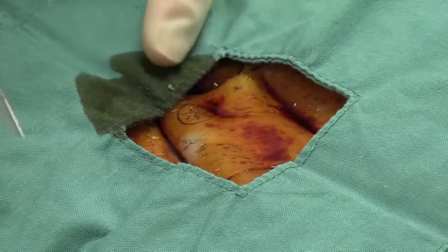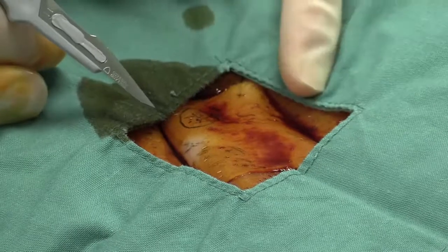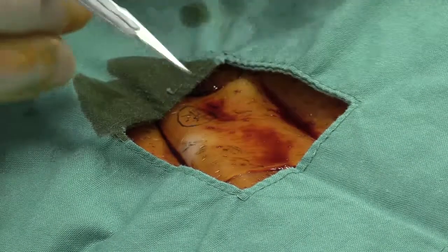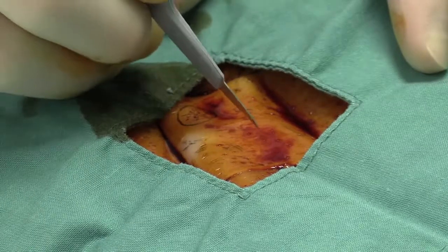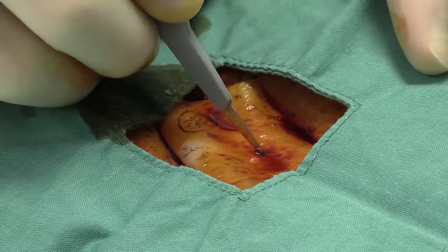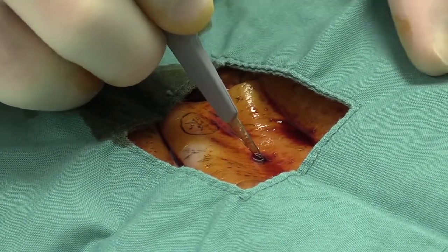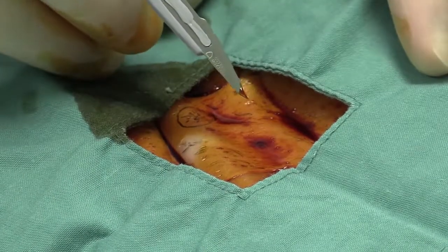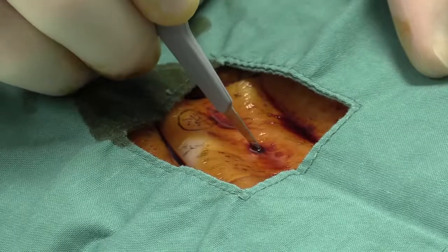incision. Again, being aware of where the umbilicus is and the two rectus abdominis sheaths, we perform a vertical incision in the midline, about 1 centimeter inferior to the umbilicus. Using the 11 blade, which is the sharp pointed blade, we perform a stabbing incision.